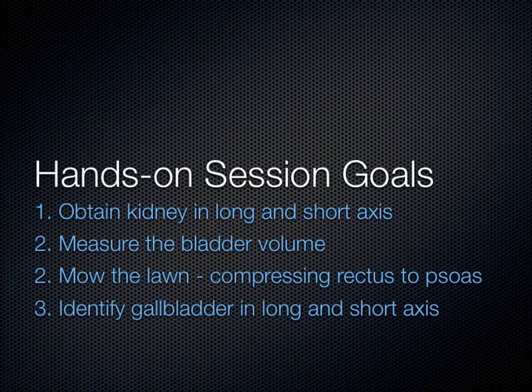Finally, this is the last slide. Just today during the hands-on session, what we're going to do is get the kidney in the long and short axis, okay? I don't necessarily need you to measure the bladder volume because that takes a little bit to stop and drop calipers and stuff. You can drop a caliper or two if you want, but I want you to demonstrate how you would do it at least to the instructors.